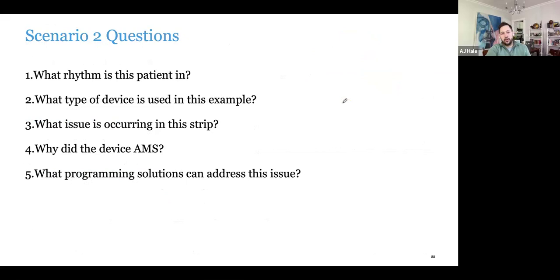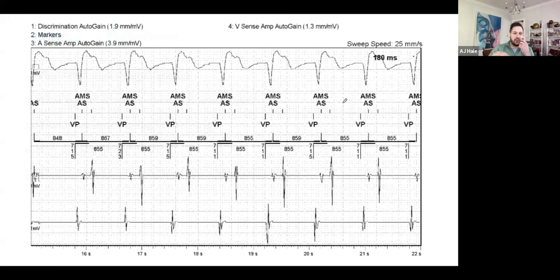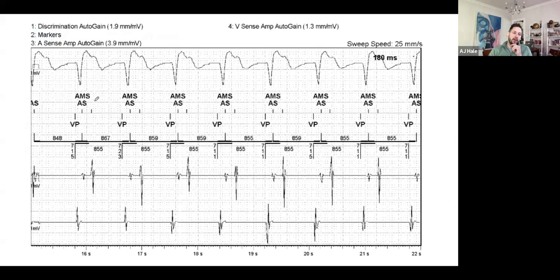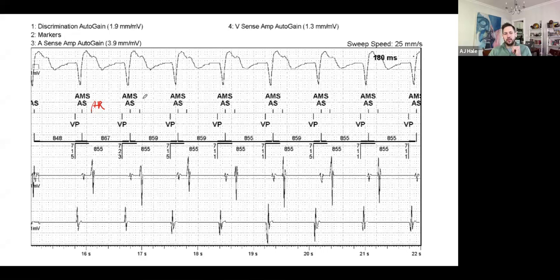Things to consider for this next one: What rhythm is the patient in? What device type is used? What's occurring on the strip? Why did the device mode switch? How do we address this issue? Right off the bat we see ventricular pacing and atrial sensing. This tick mark on an Abbott device means it's in atrial refractory — on Abbott high-voltage devices, if you see just a tick mark with no 'AR' label, that means it's a high-voltage device. If it were a pacemaker, it would say AR. We have a V pace, an atrial-sensed event, and another atrial-sensed event that falls within the refractory period. Your EGM channels: your discriminator channel is a far-field channel similar to a unipolar tip — this is actually a coil-to-can vector. Your other channels are an atrial sense amp and a ventricular sense amp.